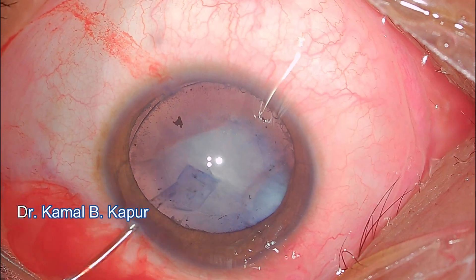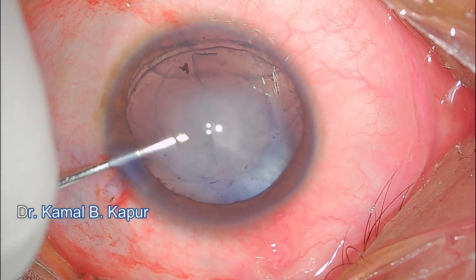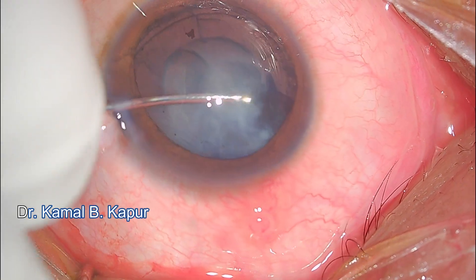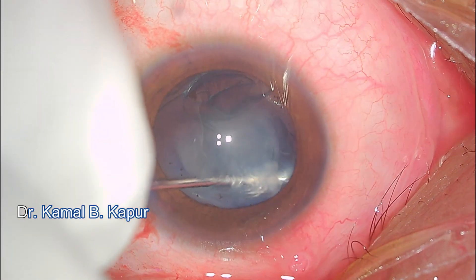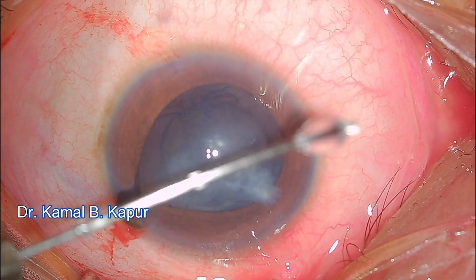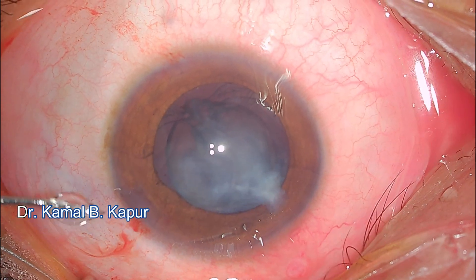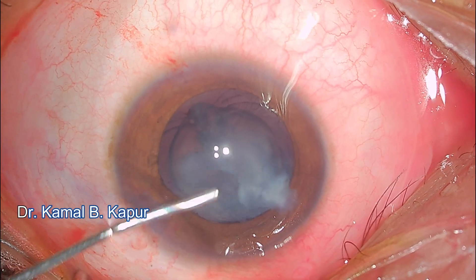The next stage must again be done very carefully. I use my special bevel cannula to perform hydrodissection — not a jerky movement, but a very slow, controlled hydrodissection because I don't want the subluxation to increase, as this is a very soft cataract. I perform controlled hydrodissection in all areas; the advantage of this cannula is that it allows work in all directions. There was a slight increase in intraocular pressure and a slight iris prolapse.